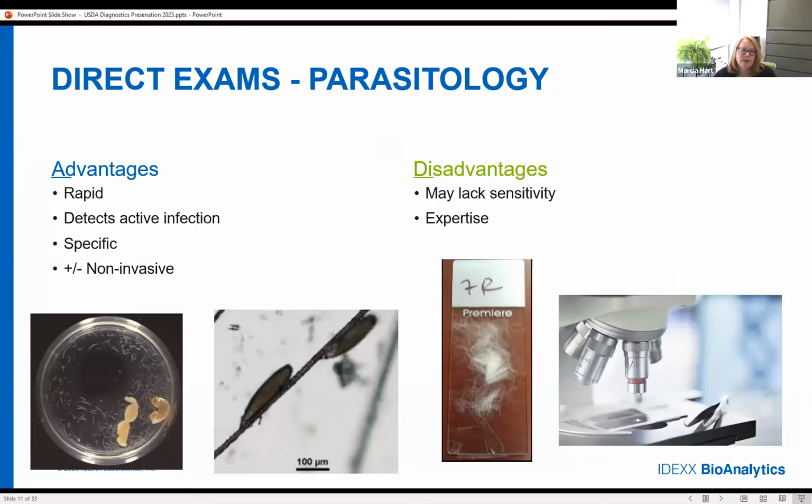Parasitology, it's a great direct exam. So the advantages here are that it can be quite rapid. It usually takes a day or two to get those test results, depending on how quickly the samples get to the lab. It detects an active infection, so I'm not looking for historical infection here, I'm looking for active infection.